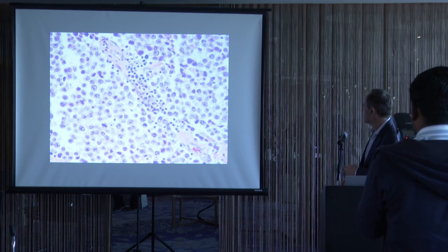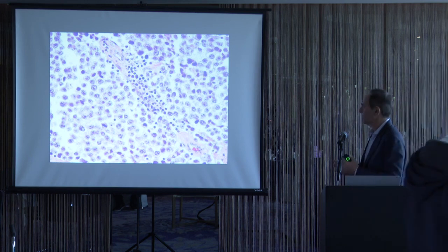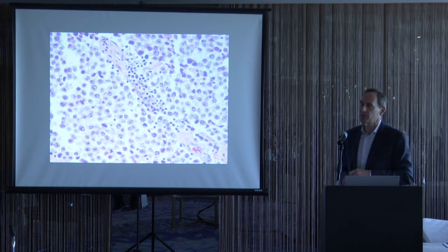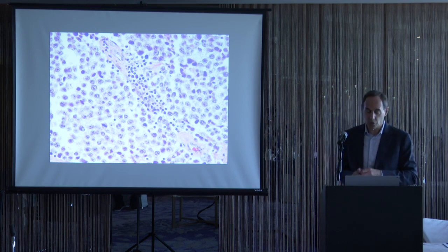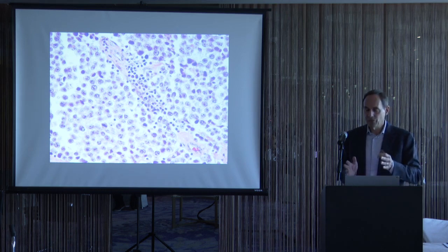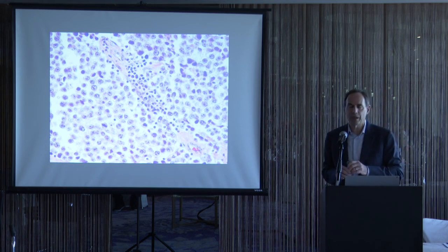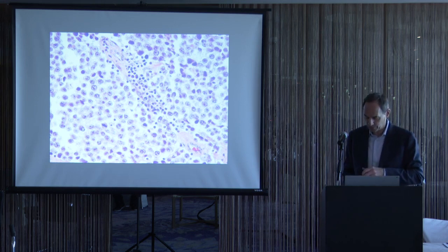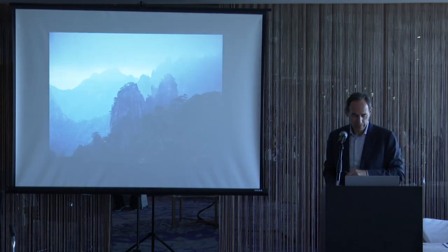Just to contrast, this is seminoma with the more open chromatin, cleared cytoplasm, a uniform population of cells, not the 3 cell types that we talked about. Now, about 85% of seminomas have a lymphocytic infiltrate, but recognize that there is a minority of seminomas where you may not see lymphocytes. It's not always present. I've also seen, even though typically in spermatocytic tumor you do not see lymphocytes, examples of spermatocytic tumor which can have a lymphocytic infiltrate. So that's one feature that may overlap between the two. Here, a little higher power of typical seminoma. This is from China.